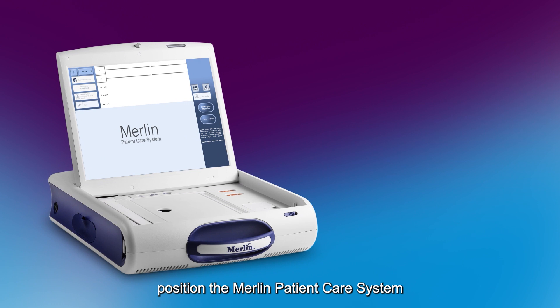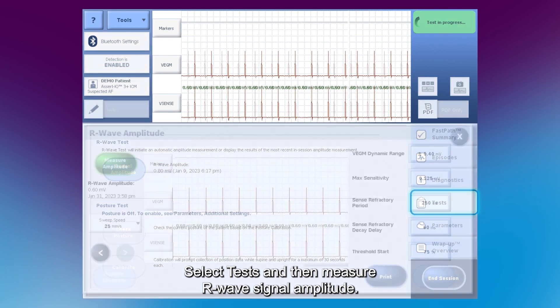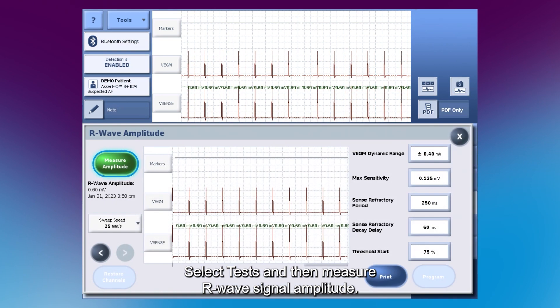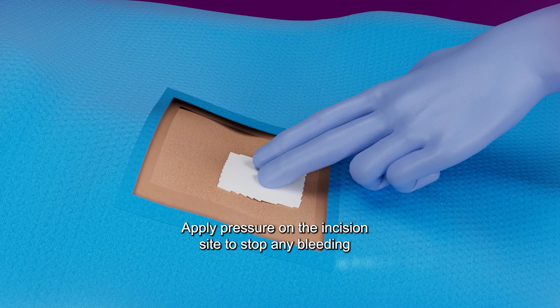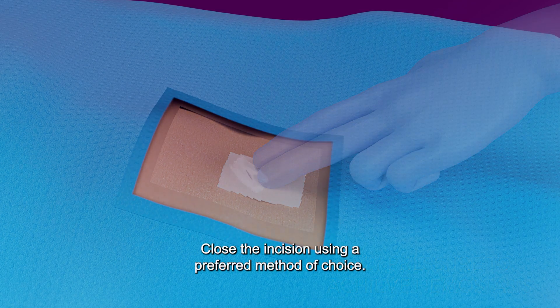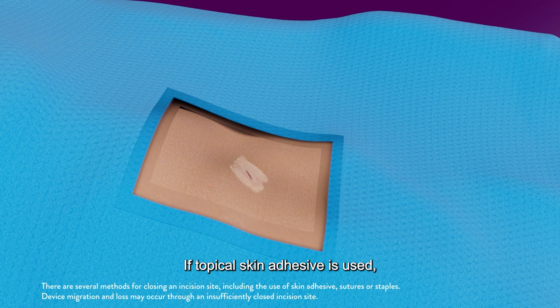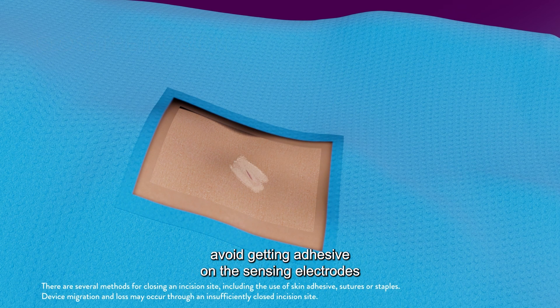If mapping is desired, position the Merlin Patient Care System within range of the ICM and select Tests, then measure R-Wave signal amplitude. Apply pressure on the incision site to stop any bleeding and achieve hemostasis. Close the incision using a preferred method of choice. If topical skin adhesive is used, avoid getting adhesive on the sensing electrodes of the device.